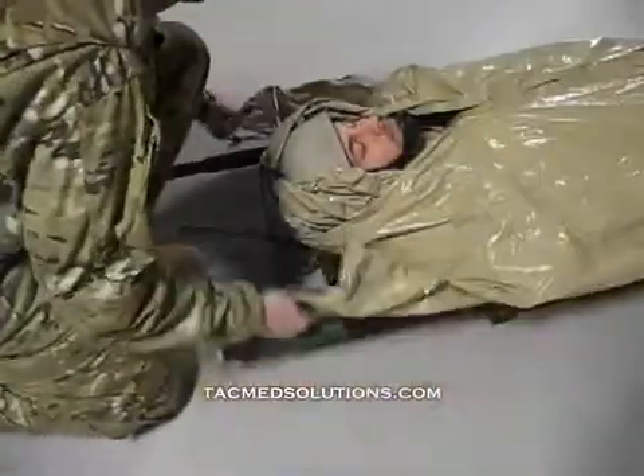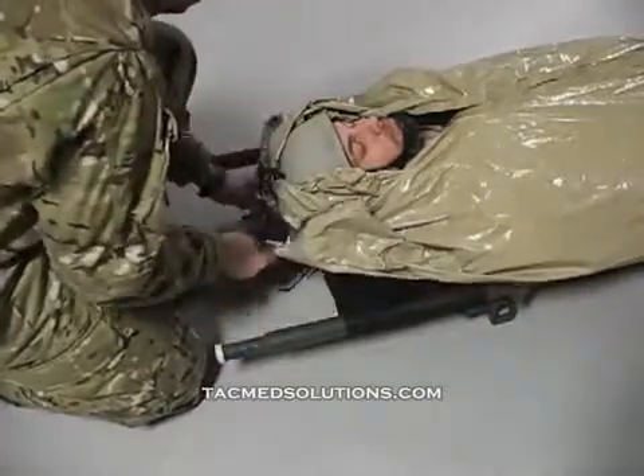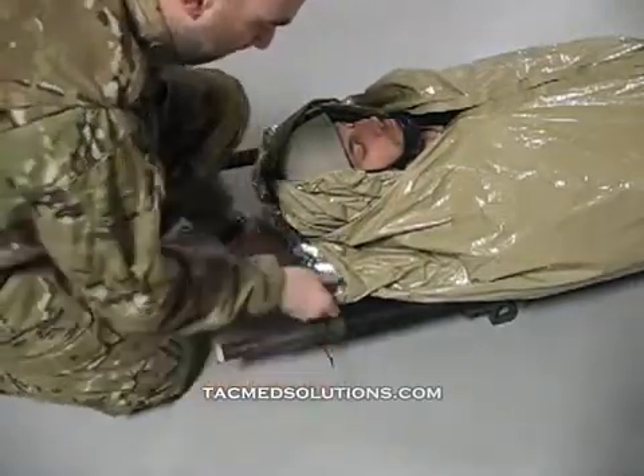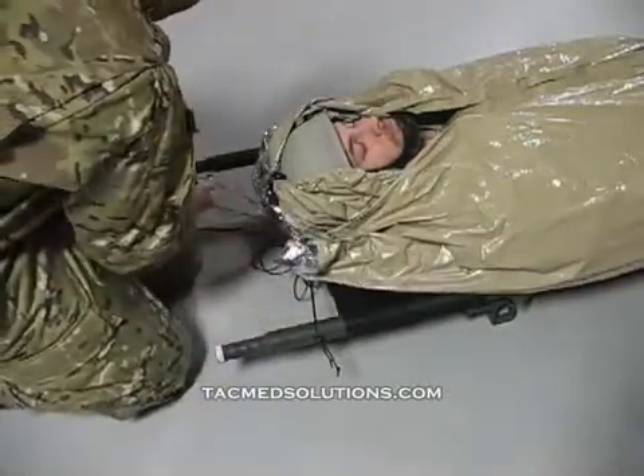The Helios system is equipped with anchors to prevent removal of the blanket in high winds or rotor wash. To attach the anchors, draw the elastic loops across and slide the loops over the handles. The loops can be tightened by increasing tension on the ball lock if required.